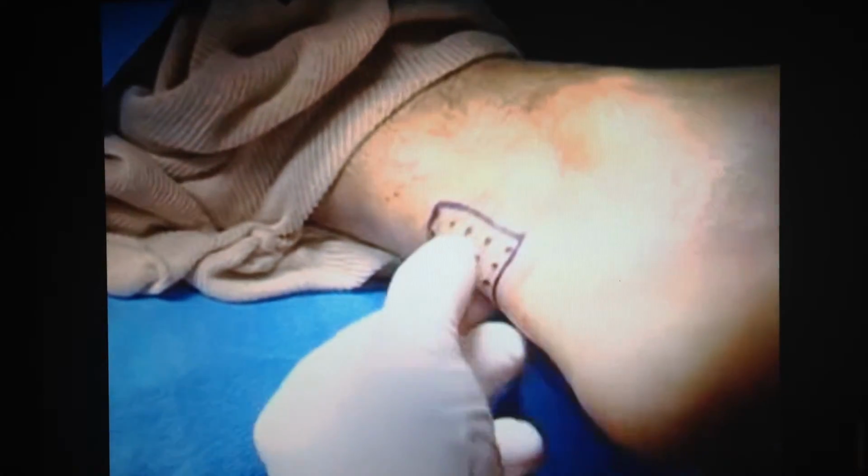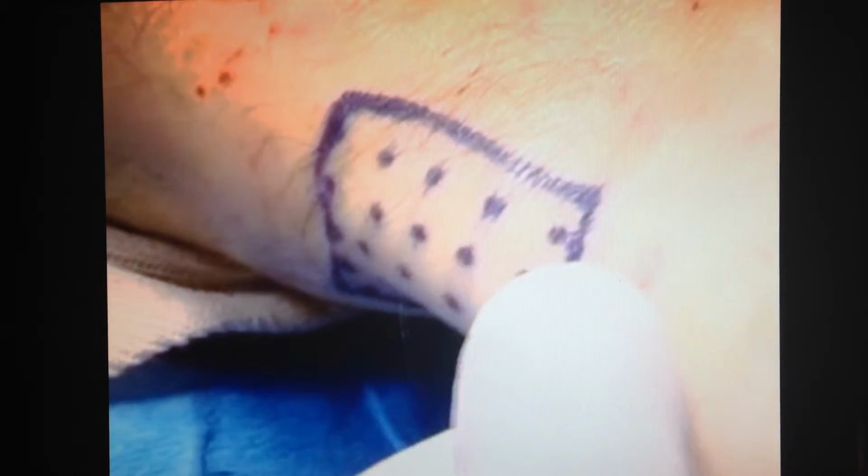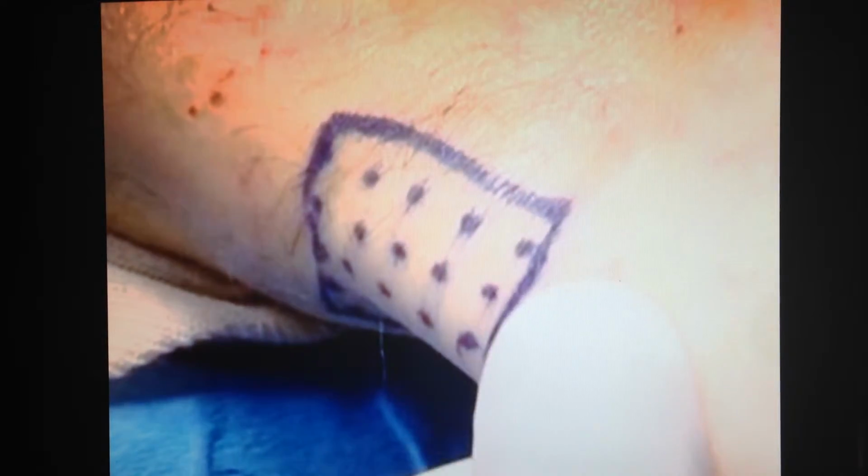This patient has been suffering with chronic pain to the Achilles tendon and has had an MRI showing fusiform thickening and degenerative changes of the Achilles tendon. Prior to the procedure, the area of pain is mapped out utilizing clinical examination as well as MRI to help isolate the pathologic area.